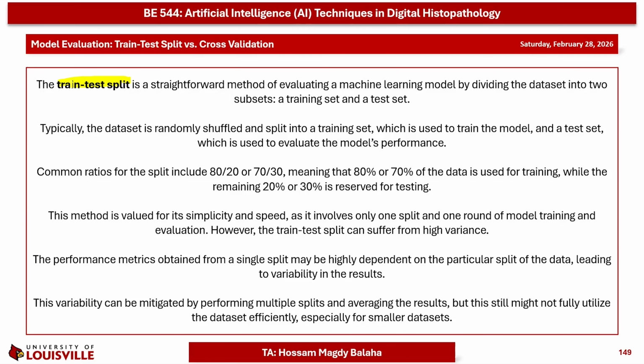The training process is done over multiple iterations, so we need to evaluate the model after each iteration and after the completion of the training process. After each iteration, we are judging the performance using the validation subset. In this case, the validation data is not seen for that iteration, but the model will get the benefit of it for the remaining iterations.